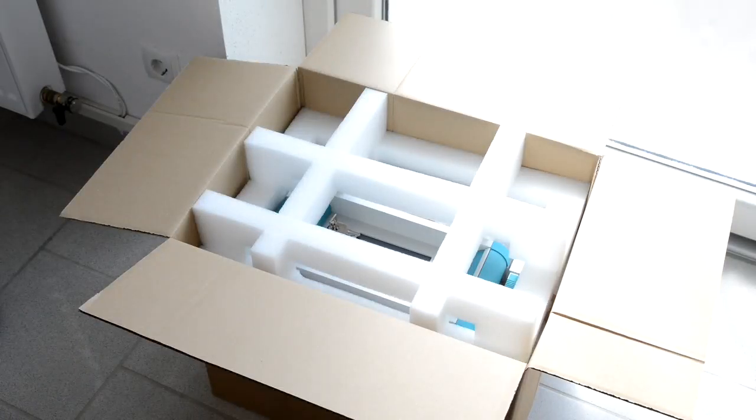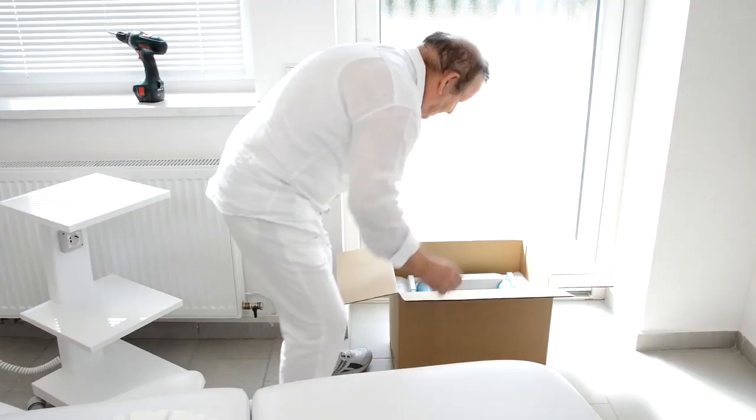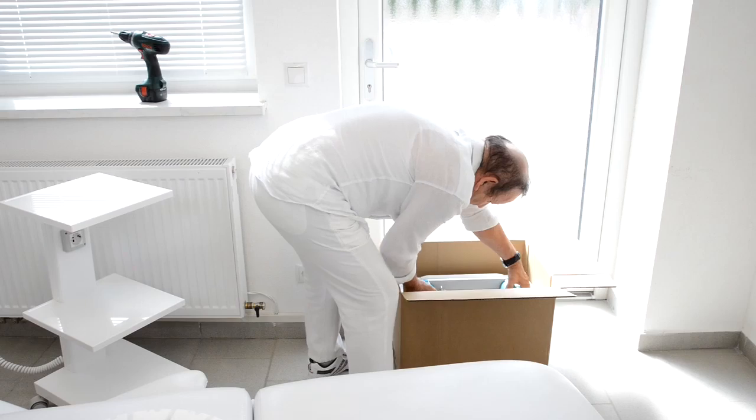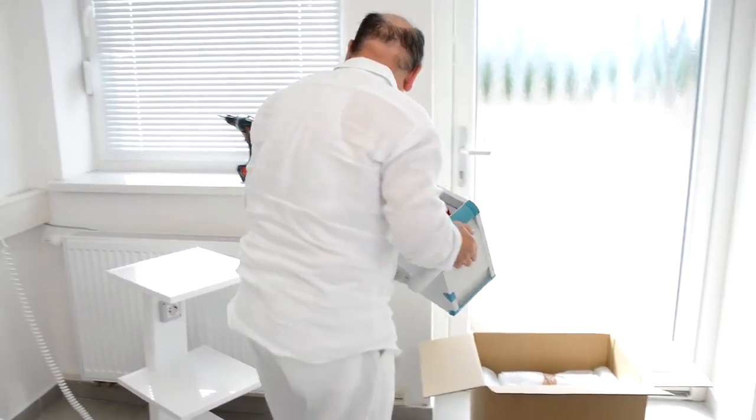Hello dear colleagues, today I want to show you how to set up the Weber Medical Endo Laser device. You see the device is still packed in this carton and I take it first out of the package.